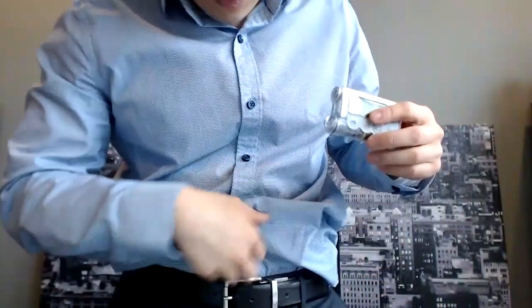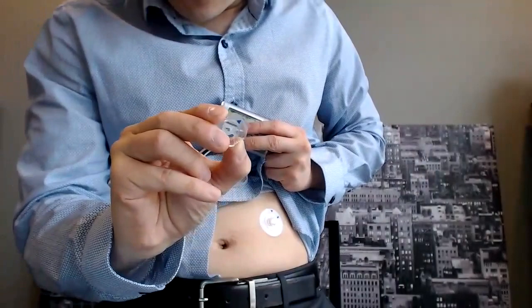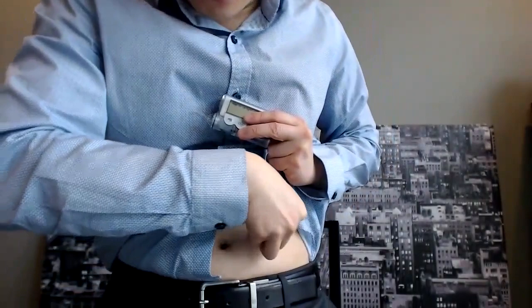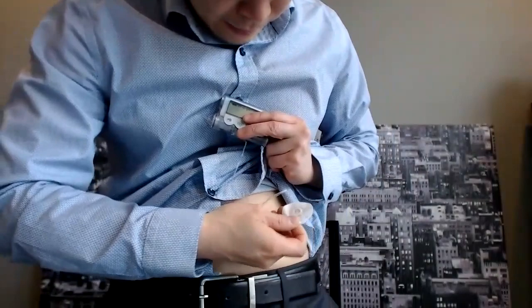So just again, to review, it is battery powered, so you need to keep it out of water. If you did want to go for a swim or something like that, all you need to do is disconnect it like so. As you can see, you can disconnect it like so. You can maybe see a little drop right there, and then reconnect it after the shower or the swimming. So I'm going to just go take this out and show you. So you can see a little drop of water there.